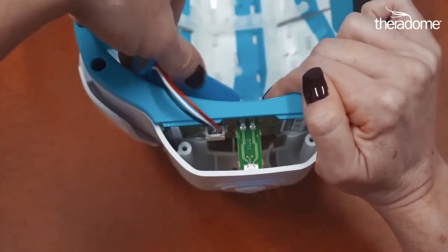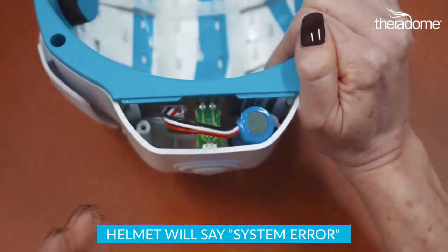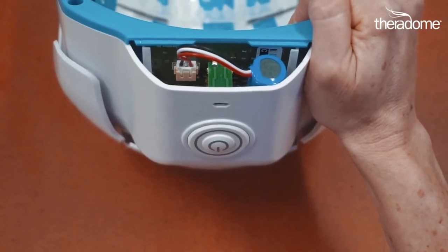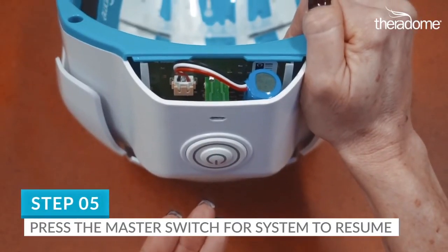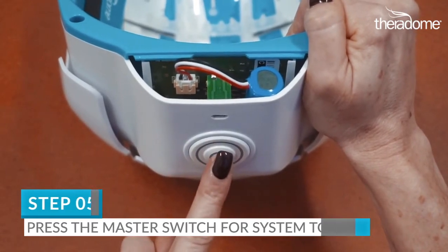When you do this, don't be alarmed. The helmet will say System Error and the master switch will flash red. This is normal. Step 5. To exit this state, you will need to press the master switch and hold it for one second.